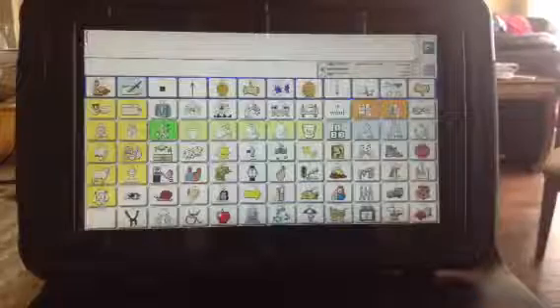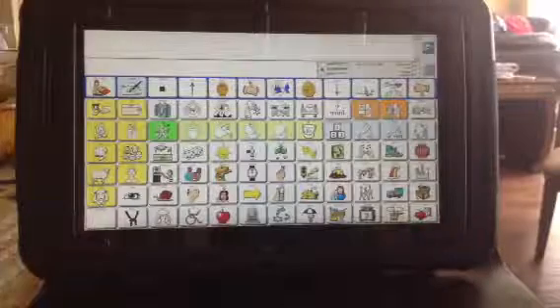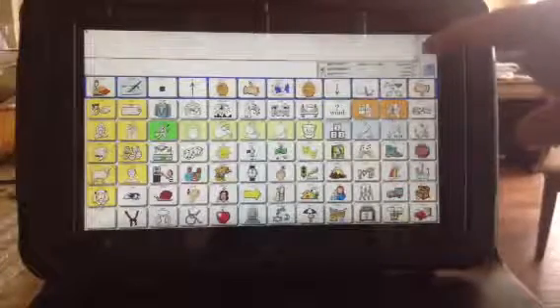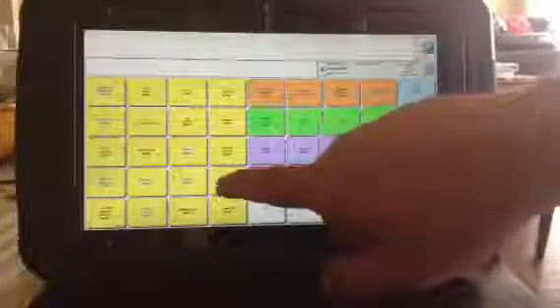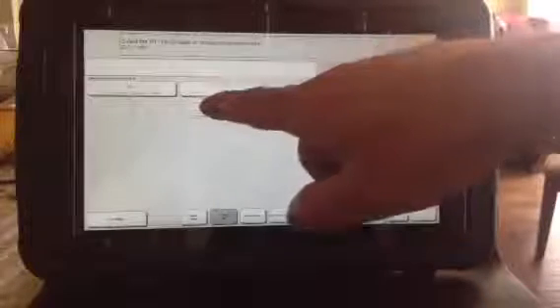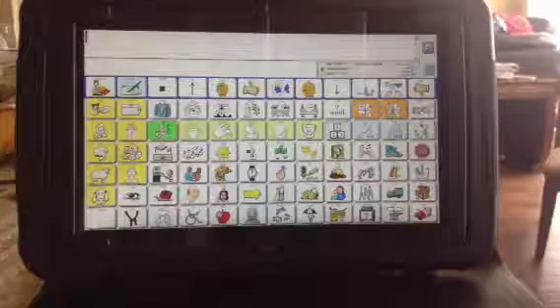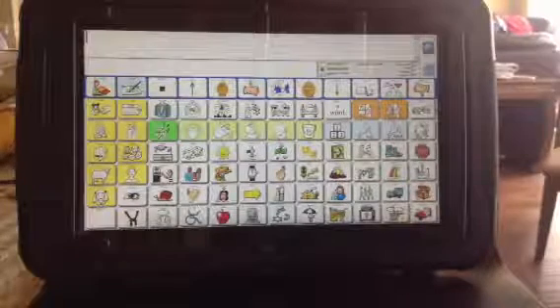Two years from now or a month from now, if I want to share this vocabulary with another student or back it up, I would do the exact same steps. Go to the toolbox, hit Transfer Memory Menu, but instead of saving, I'd do Load One User Area. It goes right to my jump drive and you can see the ones I saved. The whole-device file would show as entire device, so I'd pick that one accordingly. It's a little safer to save the entire device, but one user area is usually what most people need.